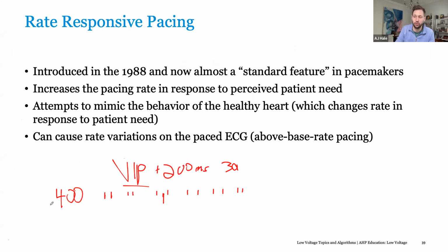So the patient could have normal, healthy conduction and degrade over the course of 10 years. And you may just extend that AV delay out when you see them to compensate for that until it gets to the point where it's too long, and then just shorten it up and consider them as a CRT candidate if you start to see degradation of their heart failure symptoms or their cardiac output starts to go down. So, make sense?